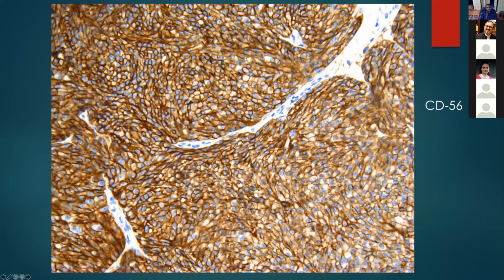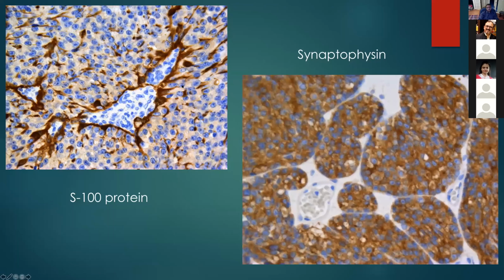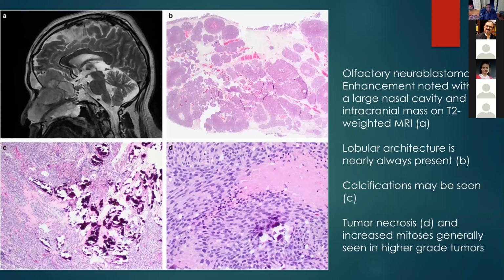Just to show you olfactory neuroblastoma, this is in the head, usually occurs in the nose in older people. This is an older gentleman who had this, but not all of them present with beautiful histology. There might be tumor necrosis, spindle cells, etc., but it's generally considered to be a good example of round blue cell malignancy. Here is another example of olfactory neuroblastoma.